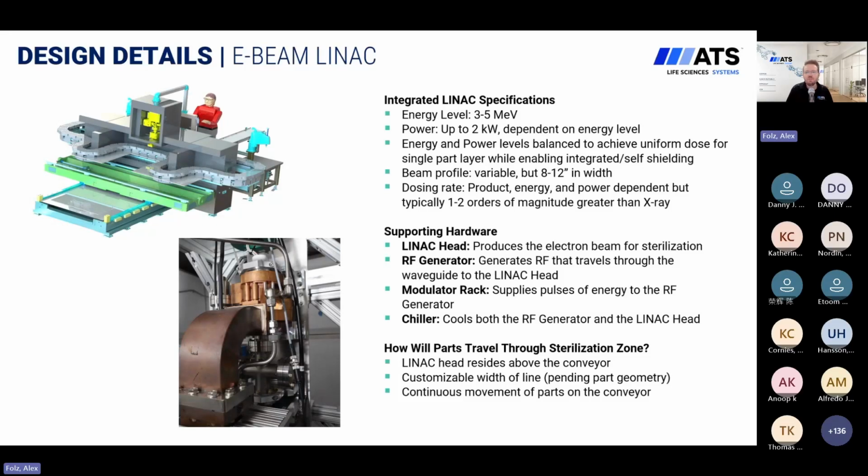The beam itself, the profile is variable depending upon your product profile. We're typically looking at about 8 to 12 inches in width. And the dosing rate is, again, going to be contingent on selected energy level, power, product, and other factors. We're typically looking at 1 to 2 orders of magnitude greater than X-ray.